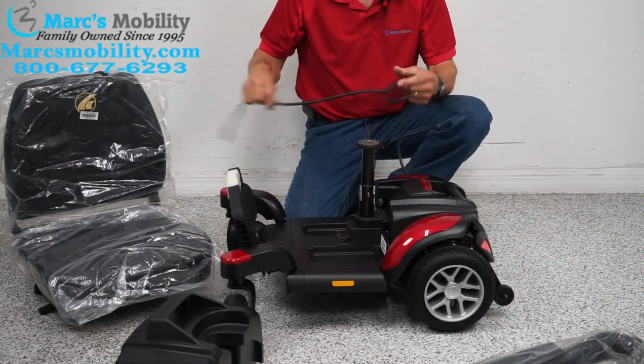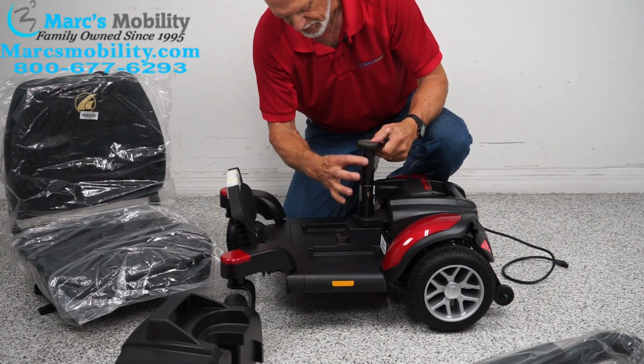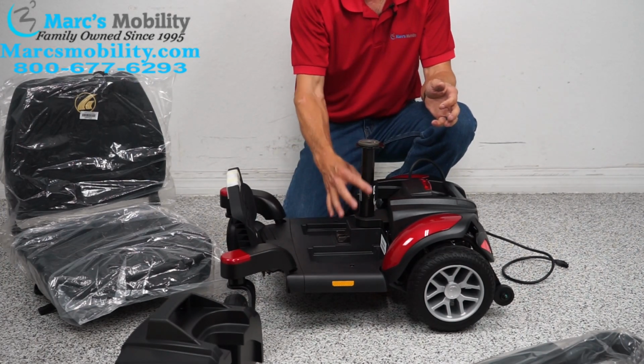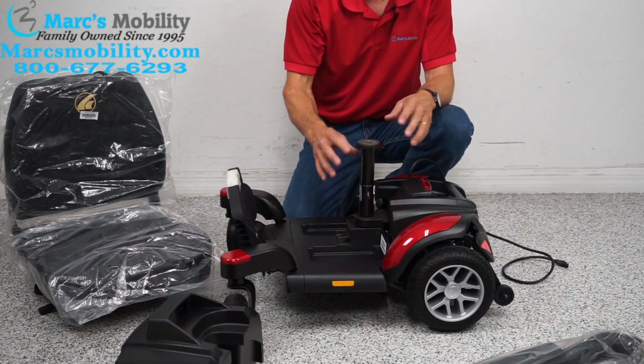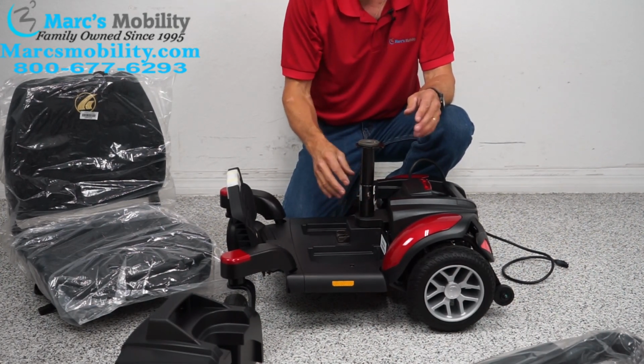If you're going to put this chair together, before you put the seat on here, you have a screw right here. You have 3 inches. You can go up or down with 3 holes. So you can go down or up in 1-inch increments. So you can adjust the height of the pole.